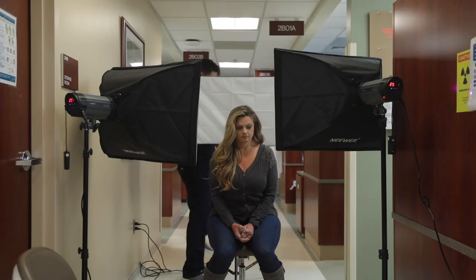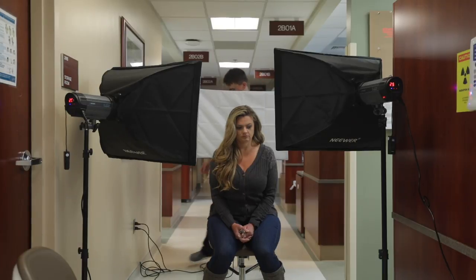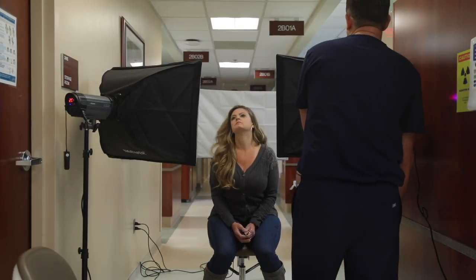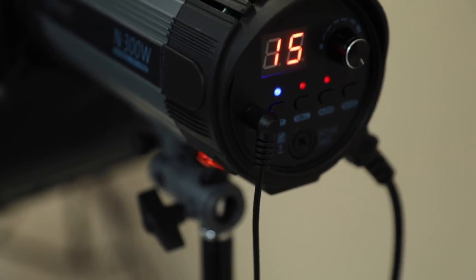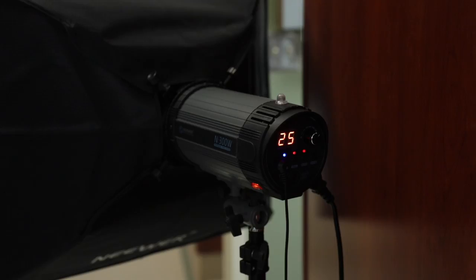To use these light boxes for these four shots, I position one light box behind my subject with the subject sitting down. I then position the other two light boxes to the right and left of the subject at around 45 degrees from the subject. Once I have adjusted the height of the boxes to the height of my patient, I turn on the light box and wireless flash trigger. The light box behind the patient is set to a power of 15, and the boxes in front of the patient are set to a power of 25.